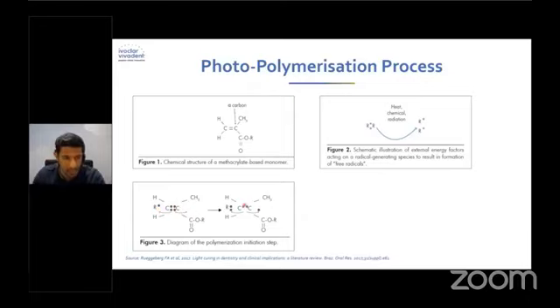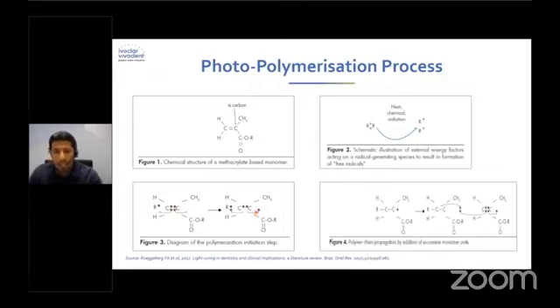So then it forms a bond there, and then what happens is, one electron from the carbon double bond becomes free, leaving behind a single covalent bond, and then it allows the electron from here to go onto the outer shell, and that forms itself a new radical, and then that goes into the medium. And then it's like a chain reaction. So one free radical is released, it hits an electron-rich area, forms a bond there, releases another electron, and then so on.